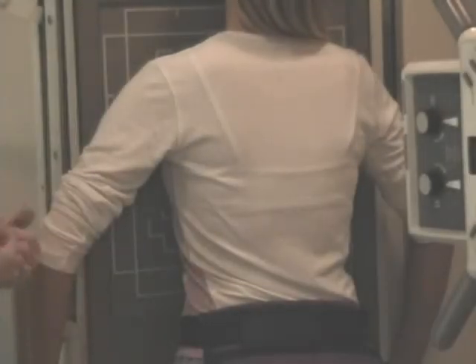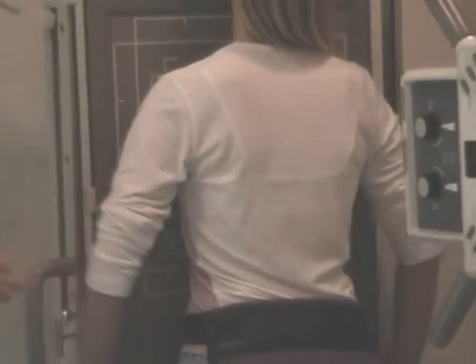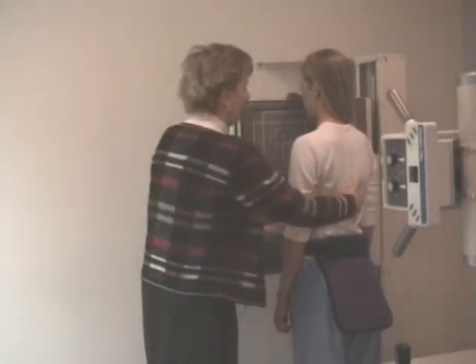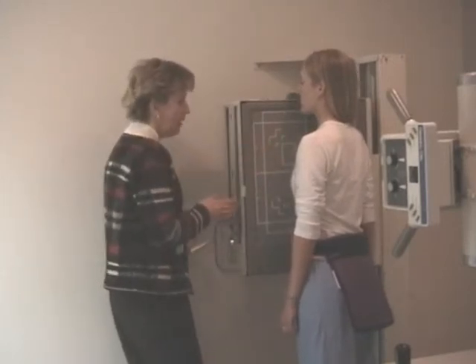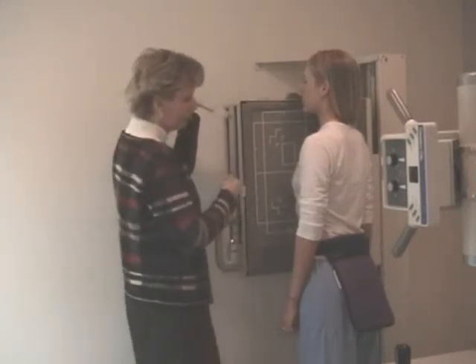There you go. And can you take in a breath, blow it out, take in another breath if you can, or just attempt one breath in, but do something to try to get inspiration. Okay? You take that picture and let your patient relax, change films. Now this is a left injury, okay? We're going to oblique the injured side away from the film in this case, so we're going to do an RAO. And since I'm after the left side, I'm going to leave the left marker on there because I'm after left ribs. Patient's height does not change, so I don't have to worry about that.